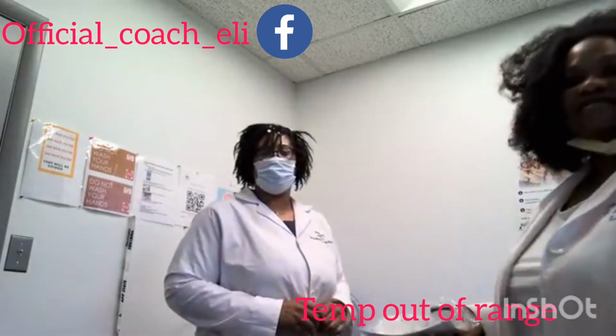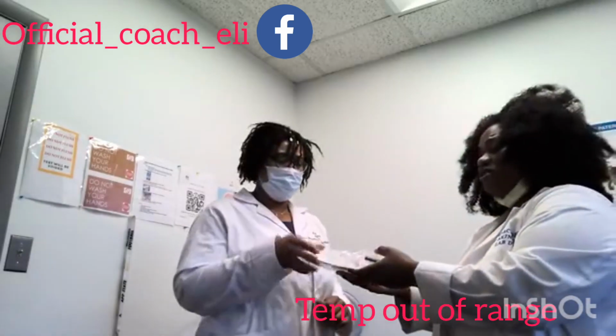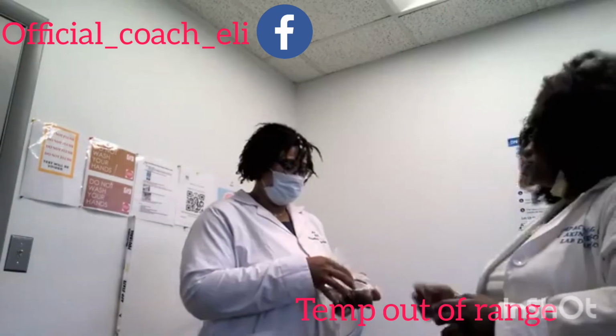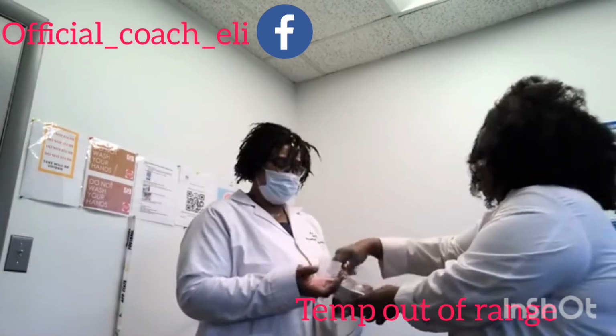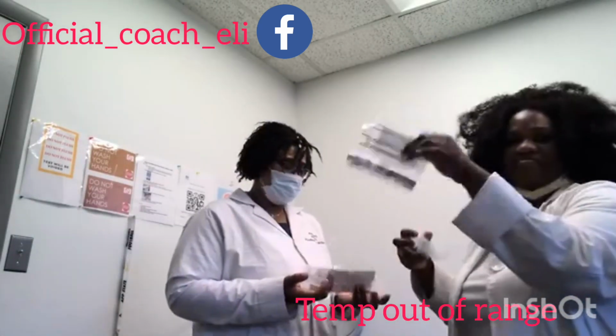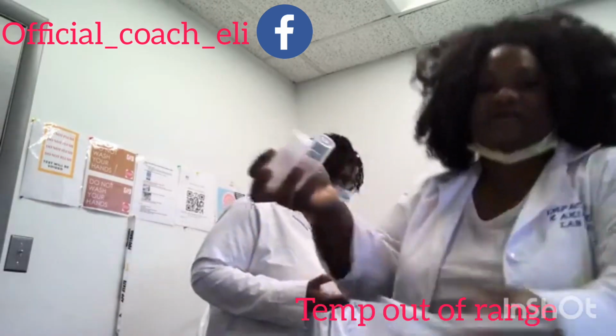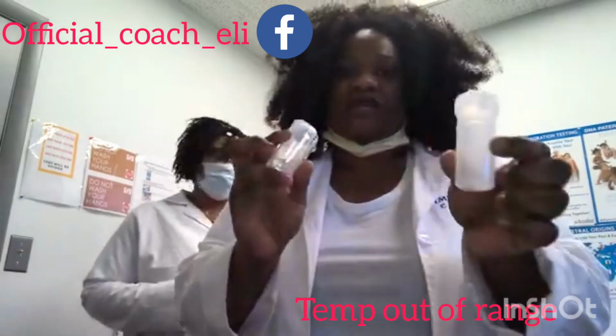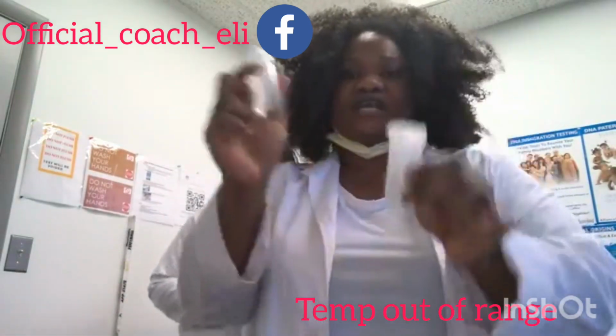So I'm going to ask her to break the seal. Can you please break the seal? Open up. And she's going to go ahead and open up and break up the seal. And I'm going to ask her to dump out the specimen bag and the 2 specimen cups. Remember, this is split collection, so we're going to have 45 in total, so 30 and 15.